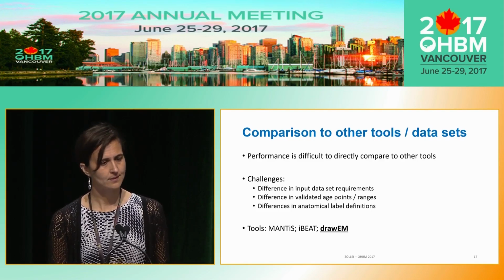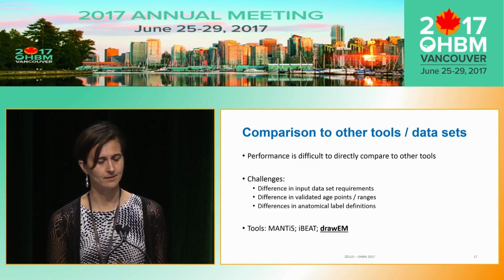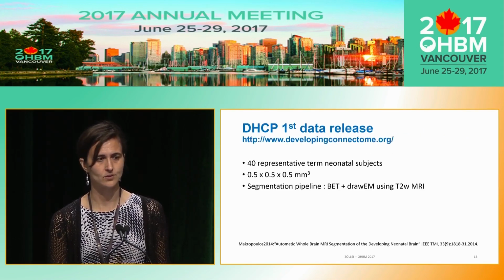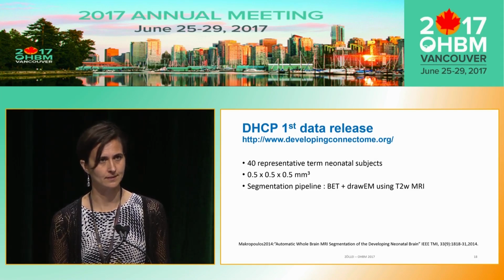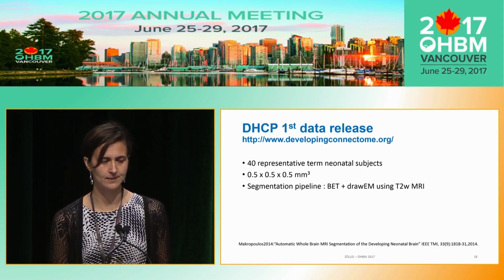Even with all these challenges, we have tested the tools Mantis, iBEAT, and DrawEM, and I'm going to show you results for the last one, given that this was the tool applied to a data set that was just recently released by the Developing Connectome project. In this data release, 40 representative term neonatal subjects and their images have been released with a resolution of 0.5 isotropic MR images.